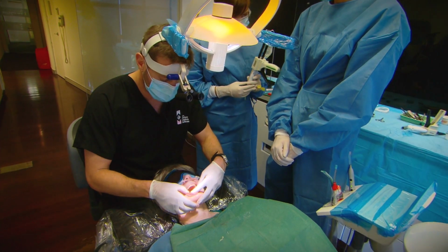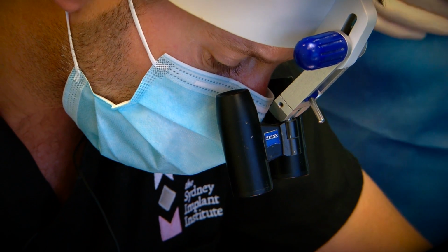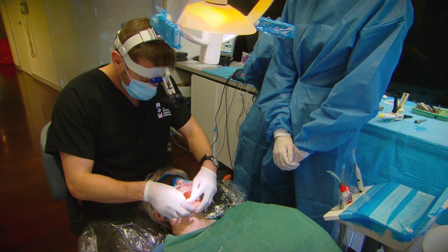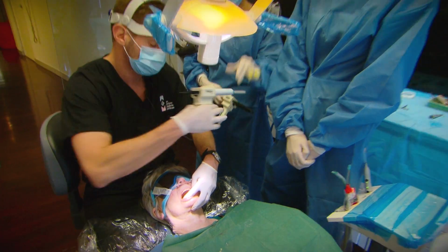We might get it moved forward a little bit, and I think Lynn's bite needs to be open a bit, but that's something we relay to the technician and he'll do. In order to be able to do that though, he'll need a bite or a registration of how these bottom teeth are fitting into the top teeth.